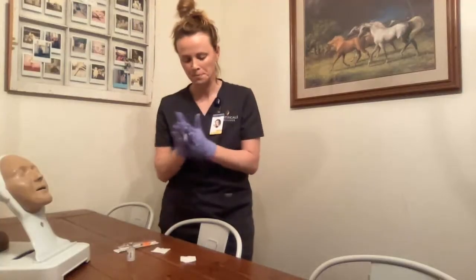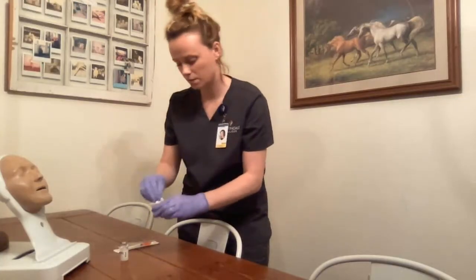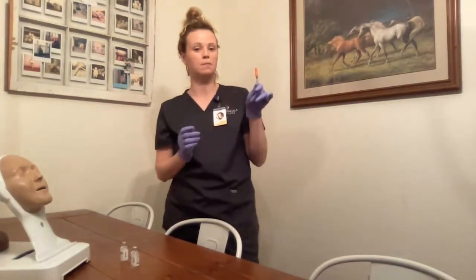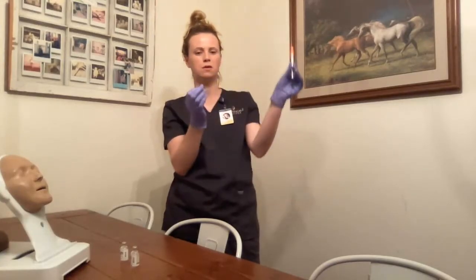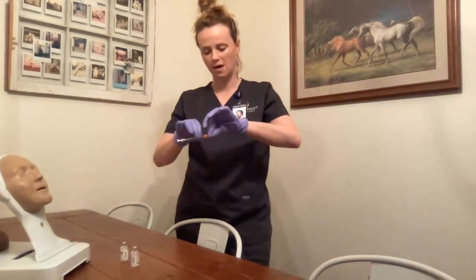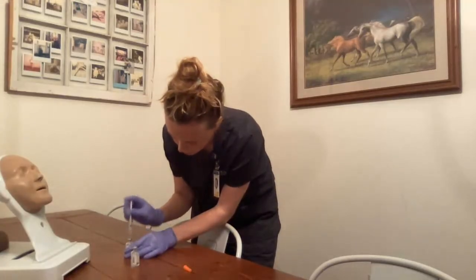I need to roll the medication vial in my hands, then clean the tops of the vials. I remove my needle and syringe. First, I will be drawing up eight units of air for the intermediate. The nurse and I verify against the MAR — eight units of air. I remove the cap and administer the eight units of air into the NPH vial. I do not want to touch the medication or draw up any fluid.